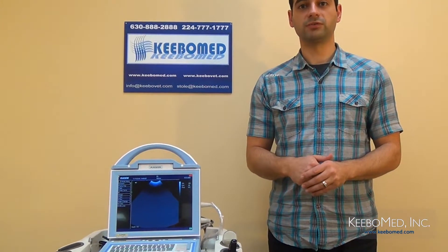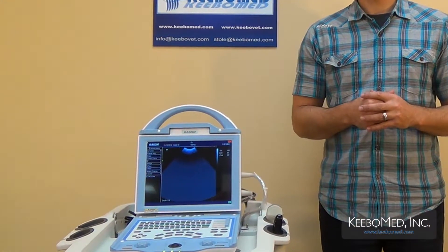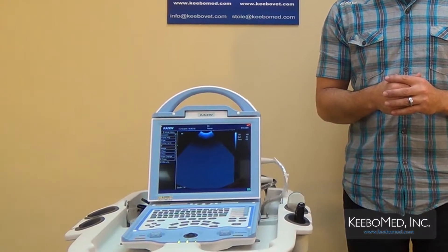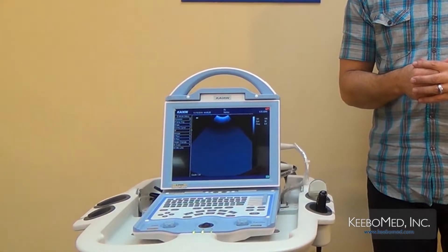Hi, I'm Timothy from KevoMed, and this is the KX5600 Veterinary Ultrasound. The KX5600 is truly one of the most economical veterinary ultrasounds available today, yet it compares very well with more expensive ultrasounds and proves to be a very good choice for veterinarians on a tighter budget. We're going to take an overall look at this model and consider some of its advantages and features.